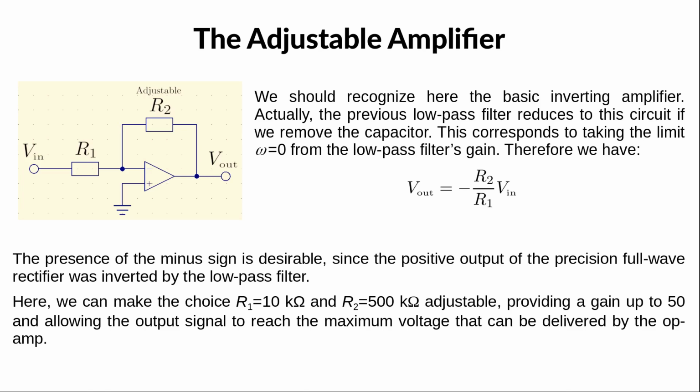The presence of the minus sign is desirable since, remember, the positive output signal of the precision full-wave rectifier was inverted by the low-pass filter. For the component values, taking R1 equals 10 kiloohm and R2 equals 500 kiloohms adjustable results in a gain that varies from 0 to 50, allowing the output signal to reach the maximum voltage that can be delivered by the OpAmp.